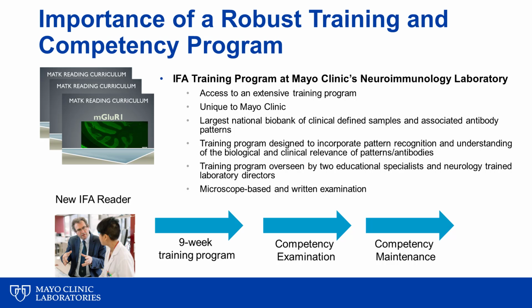After this 9-week program and the competency evaluation, we still maintain our competency through regular yearly evaluations of a reader's performance across all reportable antibodies. This is extremely important to ensure that the quality of the interpretation being provided to clients offers a high degree of confidence as well as accuracy.